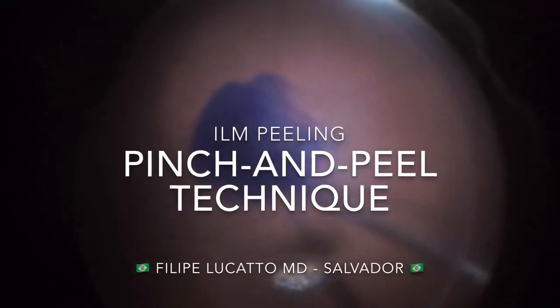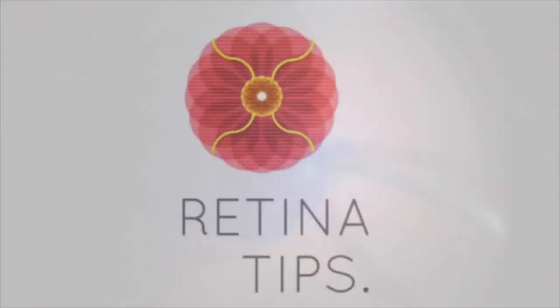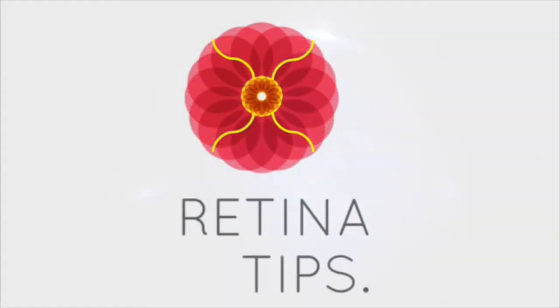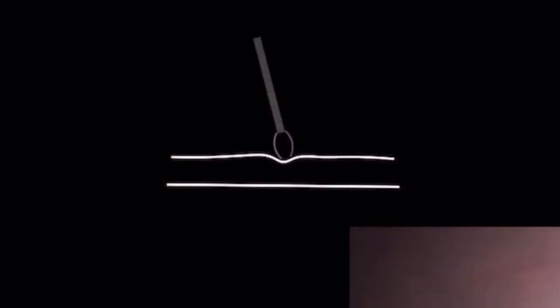In this video we discuss tips to peel the internal limiting membrane. First of all, it's important to pay attention to your forceps tip and respect the correct position to ensure that both tines touch the ILM simultaneously. Don't try to grab the ILM and make a circumferential tear at the same time. The open jaws of the ILM forceps should be placed on the surface of the retina, pushing enough to identify the surface.